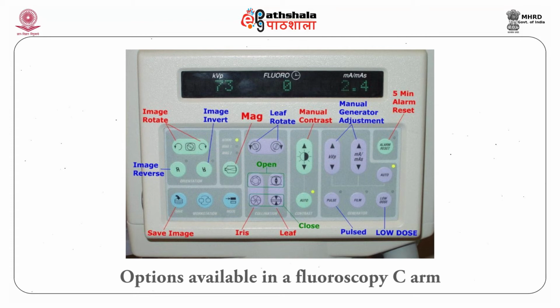There are also magnification modes in these machines. In some machines, there may be about 6 magnification views, but in the smaller machines, there may be 2 magnification modes.